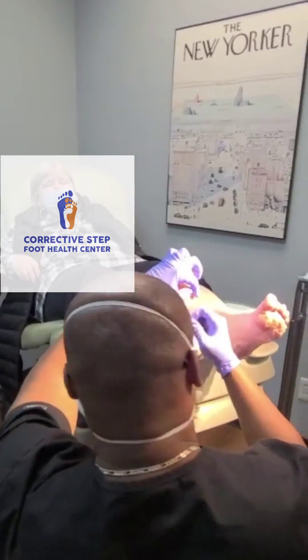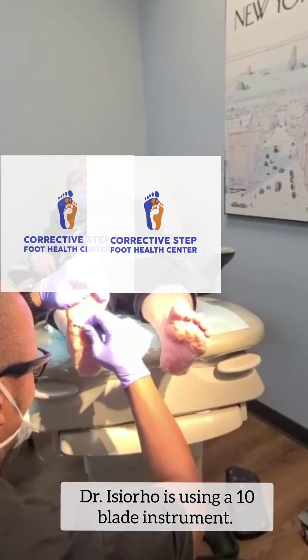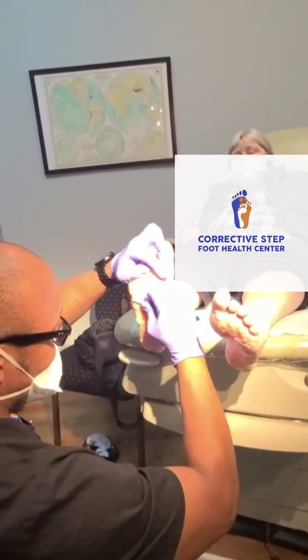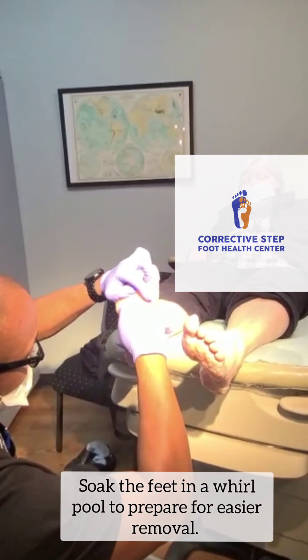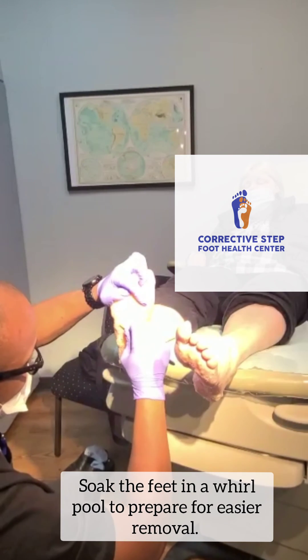Using my 10 blade, I'm just working my way around. These lesions have been softened up by my staff using a whirlpool and some warm towels.